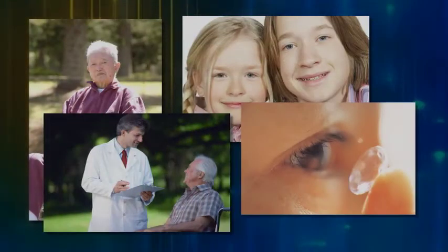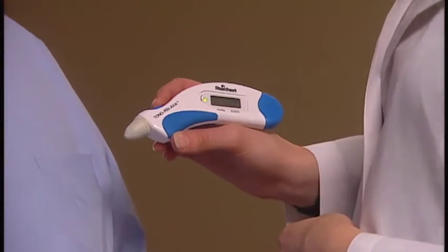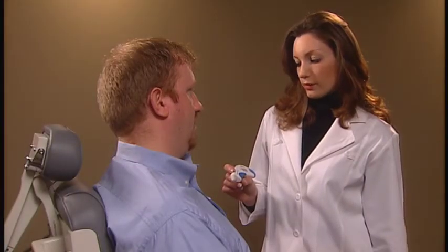Children, the elderly, wheelchair-bound patients, and soft contact lens patients can be examined easily. The simple handheld design of the device means that it can be easily used by a physician, nurse, or technician.